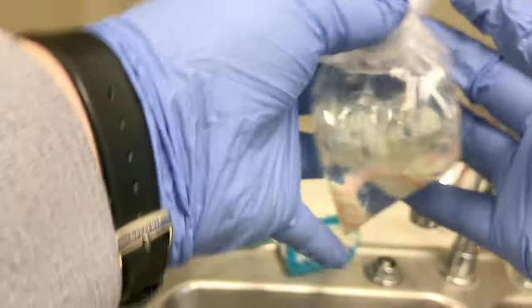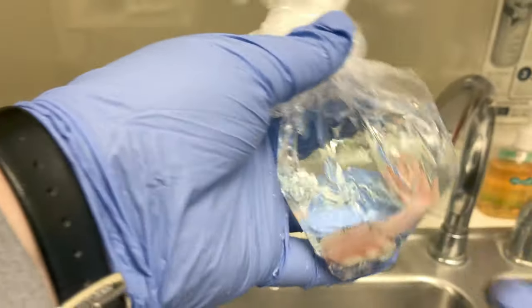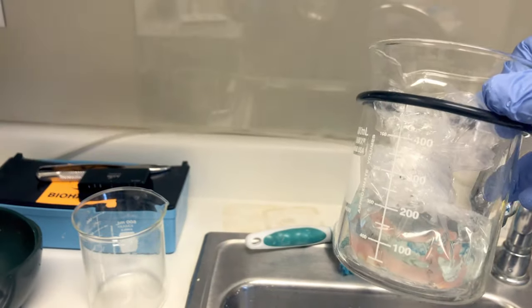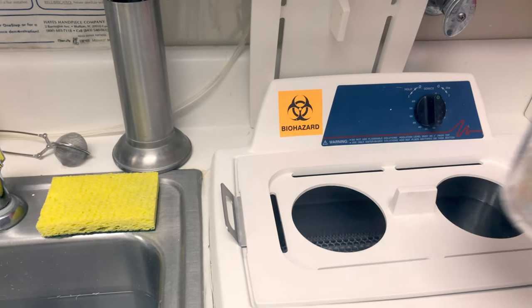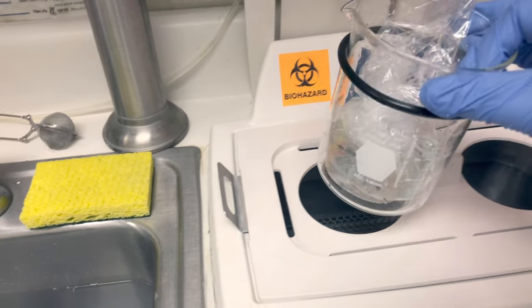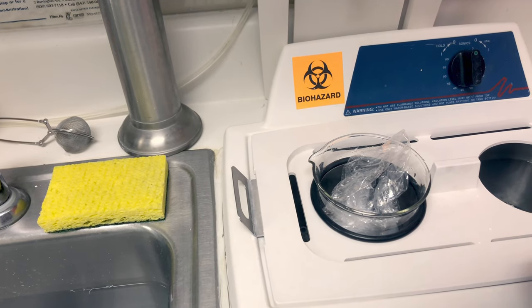We're going to use the beaker as that second barrier to prevent the bag from getting contaminated. Also, there could be pinholes in that bag that could allow ultrasonic solution to leak inside. Use the beaker with this little rubber gasket on it — that'll help stabilize it. Use a clean, disinfected beaker. Put your beaker into the ultrasonic cleaner with the special lid that has a hole to allow you to stabilize your beaker. That rubber gasket will help to seat the beaker properly into that opening.